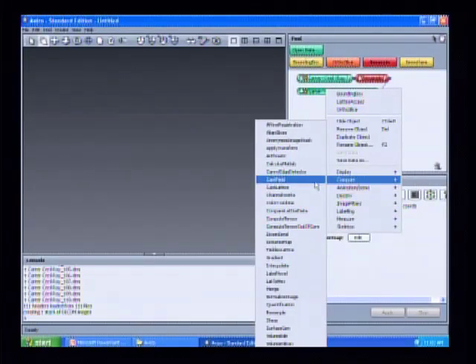The reason that we're doing this is the metal in the CT scan, sometimes from cavity fillings or any other dental implant, would cause severe scattering in the mouth that would overcome the mandible and some of the other portions of the skull, which was a pretty severe problem for some of our data sets. We would do this to try to reduce that metal artifact effect.